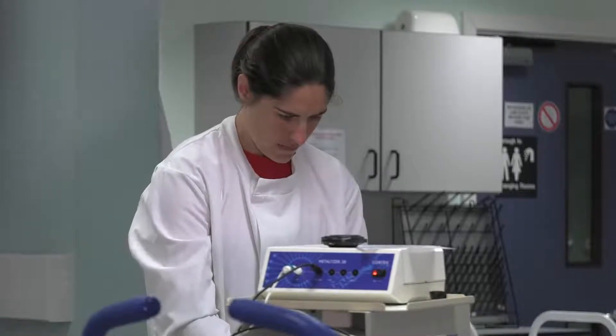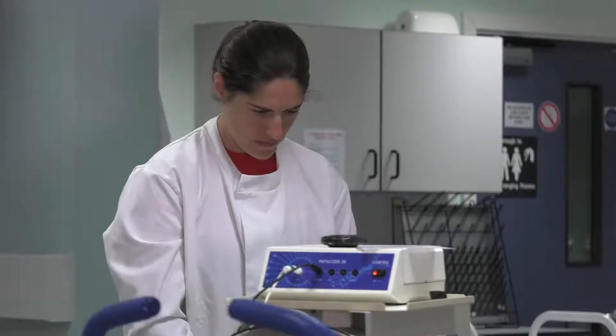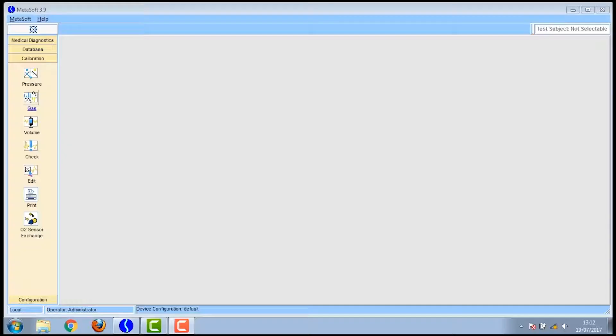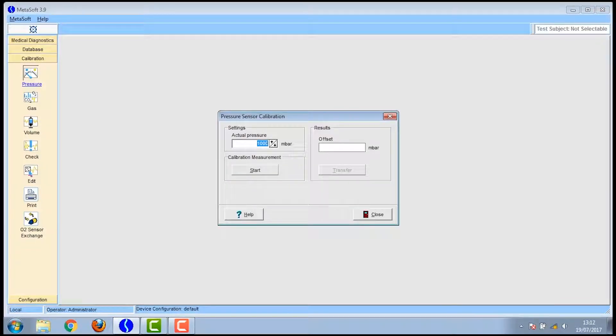Initially you need to load up the Metasoft software on the laptop and start the calibration process. As you can see on the left hand side of the screen there's a series of calibration tests.